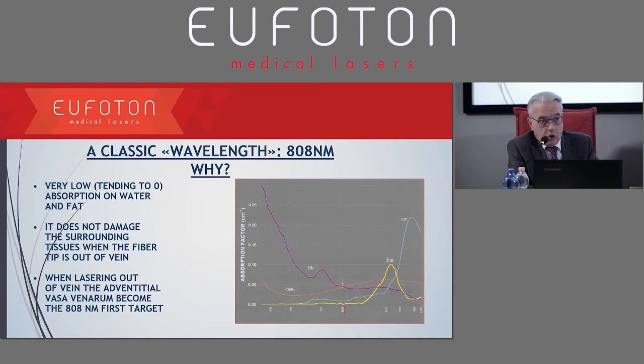So why is this wavelength of 808 optimal? Because it has a very low absorption with water and fat. So imagine a telangiectasia. When we have to use the cannulas, it's very hard, but when we are close to the telangiectasias, we have no absorption on water and fat.